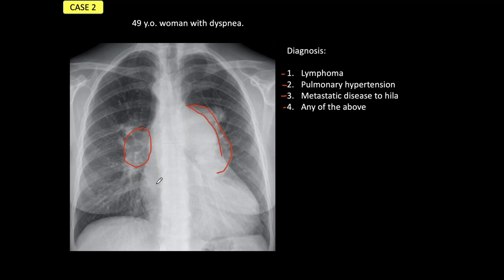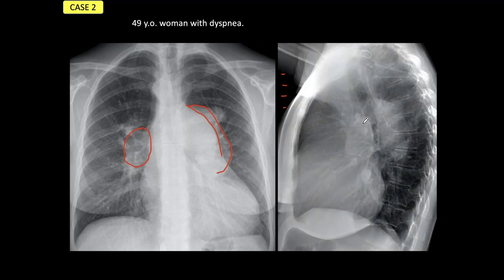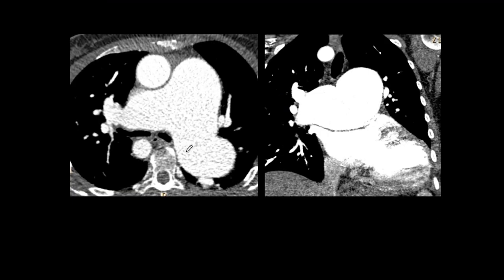So pulmonary arterial hypertension would be the diagnosis here. In the lateral view, we confirm that what we are seeing are not lymph nodes but the right and left pulmonary arteries, one anterior and the other posterior to the axis of the trachea. We confirm the diagnosis with clinical examination, clinical tests, and CT. This shows a markedly enlarged main pulmonary artery compared to the aorta, and enlarged right and left pulmonary arteries. In the coronal reconstruction, we also see the right aortic arch in the upper portion.